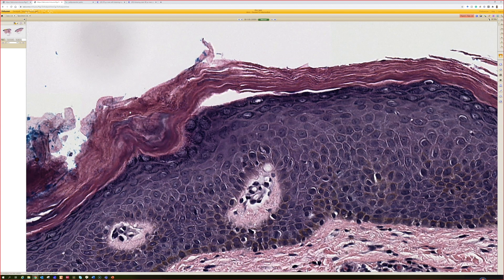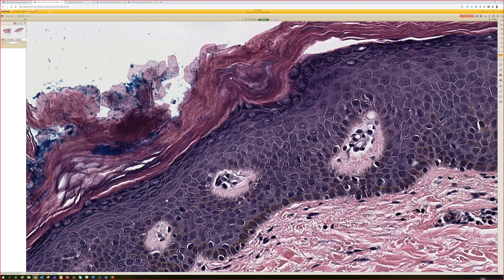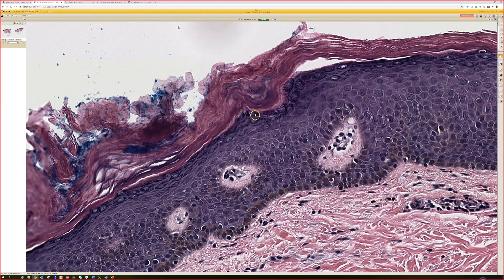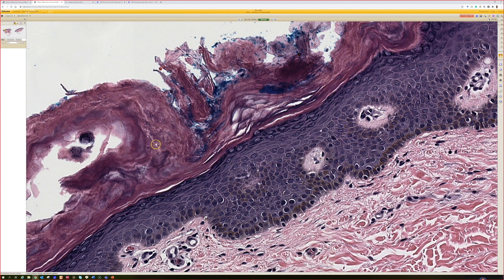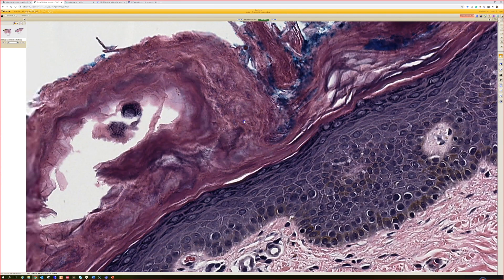If they're tiny, you think about erythrasma. And if they're larger, candida or dermatophyte. But they are so small here that it kind of steered me away from fungal, more into erythrasma.